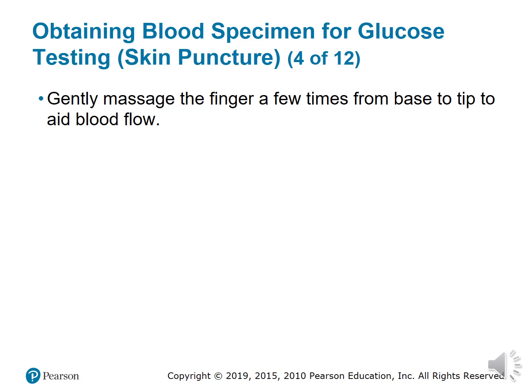This is another way for you to also check your patient's temperature. If a patient's hands are cold, you're not going to get a good sample, because that's a telltale sign of poor circulation. So if your patient's hands are cold, you can warm their hand up by placing your hands on either side of their hand and rubbing, or you can get a warm towel and wrap the patient's hand in it.